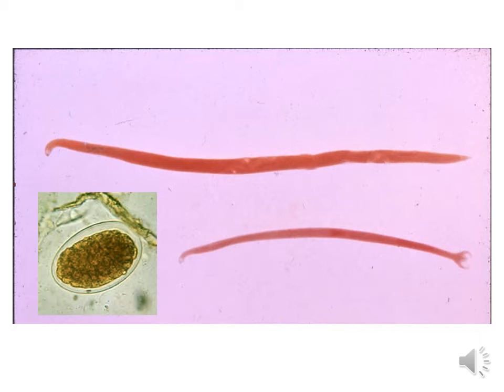The eggs of Ancylostoma and Necator are very typical and indistinguishable, and you could see the one here, it is showing a very thin eggshell. So if you are suspecting a hookworm egg, please reduce the illumination or the light of your microscope. If it is too strong a light, it will be difficult to see the eggshell, but you see those developing morula of cells.